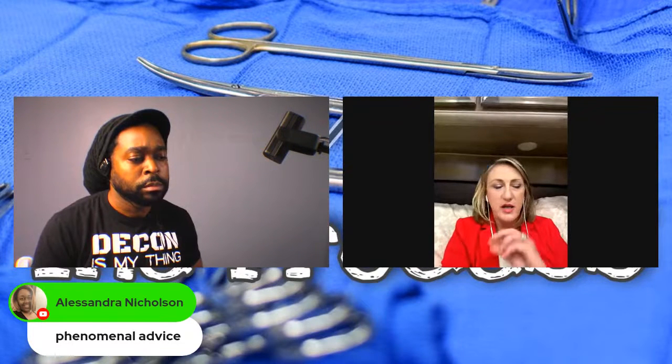Another thing I like to do is look at water sources. Take a napkin and put it up to your sink faucet, and when you pull it out, see if there's any bacteria growing inside of it. If there is, it'll be either green or a slimy pink color, so you know that you have bacteria growing in those sinks. These are things people in sterile processing don't look at because they don't think about it. Water quality is one of the things you need to think about.